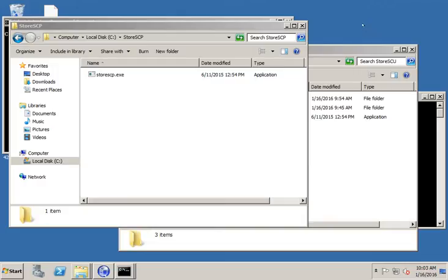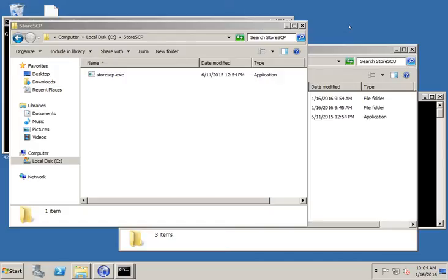Sometimes when troubleshooting DICOM networks, it's helpful to use some troubleshooting tools to both send and receive DICOM files without having to use a vendor's application to do that. So if you're testing a vendor's application's ability to receive a DICOM file or to send DICOM files to another SCP, these tools can be helpful.